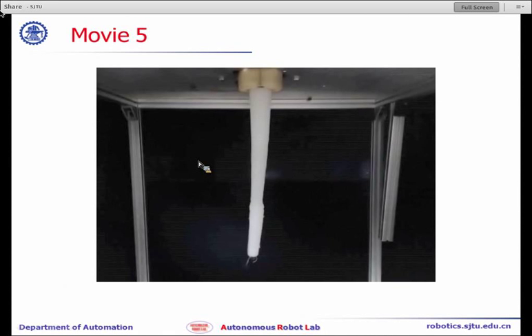So we combine a few of the behaviors. We can see that this robot can perform some actions and they can have an S curve. Actually, this is very important for some surgery. They need to avoid some muscle and reach the back part of the human heart.